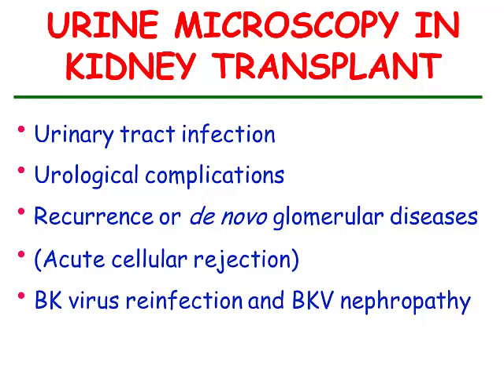And in the last few years, a new disease turned up which appears to be important in patients with a transplanted kidney. This is due to the reinfection of the subject by BK virus. So the talk of today will be focused on that, on the contribution of urine microscopy in diagnosing this condition.